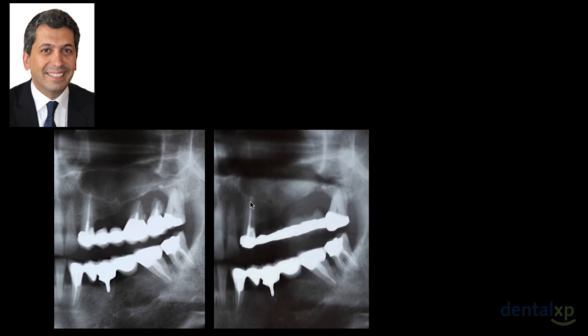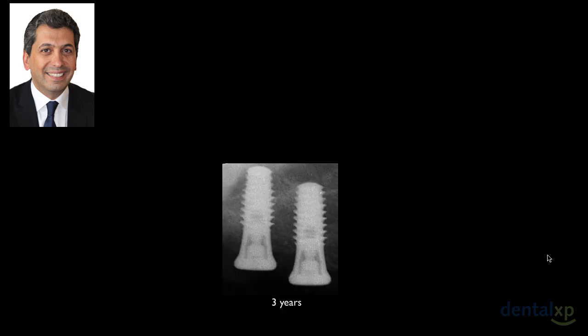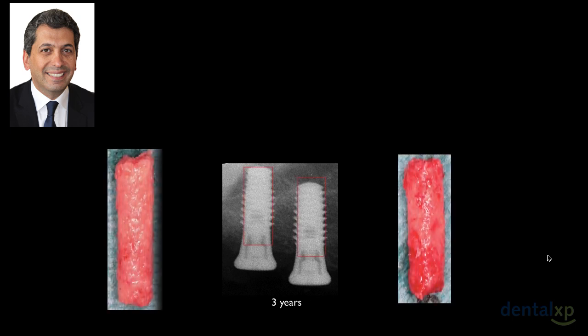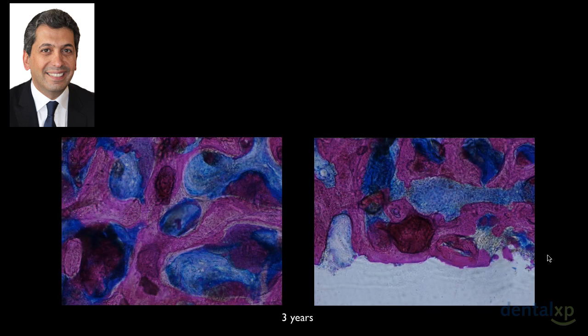And you can see that the patient had a very nice temporary bridge, and he was very happy with his temporary bridge that he did not come back until 3 years later when he lost the tooth that was supporting his temporary bridge. We were lucky at that point to be able to retrieve biopsies of a sinus that was grafted 3 years earlier. And when we took this bony trephine, we could analyze in detail what's going on inside.